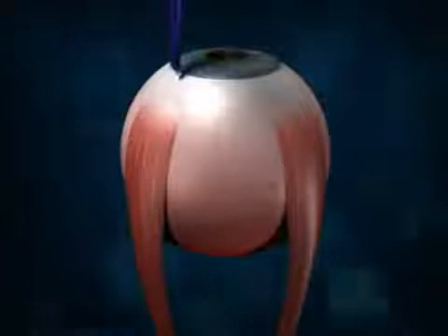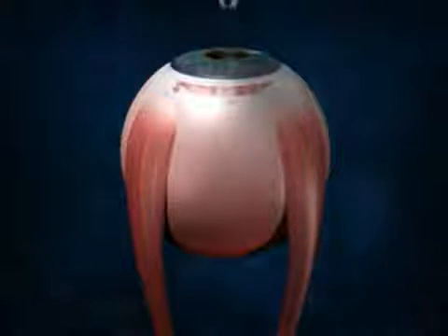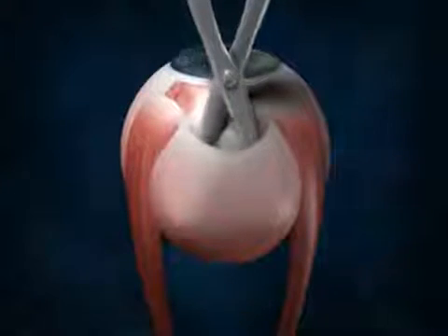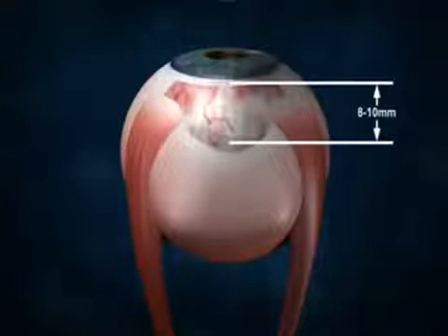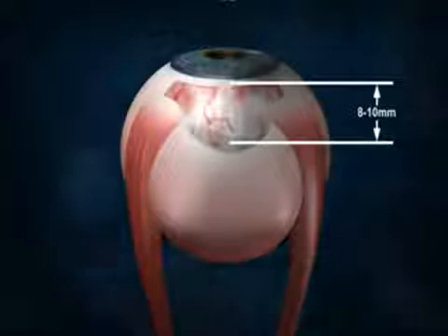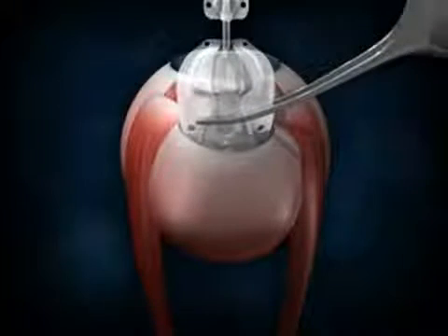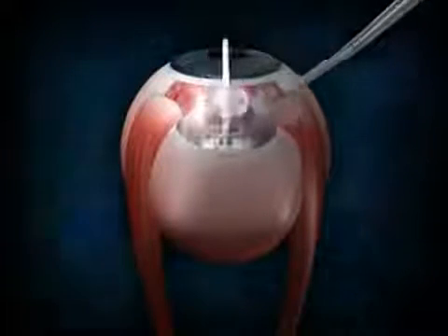Take a sharp scalpel and make either a limbal or fornix-based incision. Using blunt Westcott scissors, expand this incision, making a deep pocket between the rectus muscles. The pocket should be deep enough for the valve to slide 8 to 10 millimeters away from the limbus. Always begin by holding the valve at the edge and push it into the previously created cavity. The valve will slide in easily.